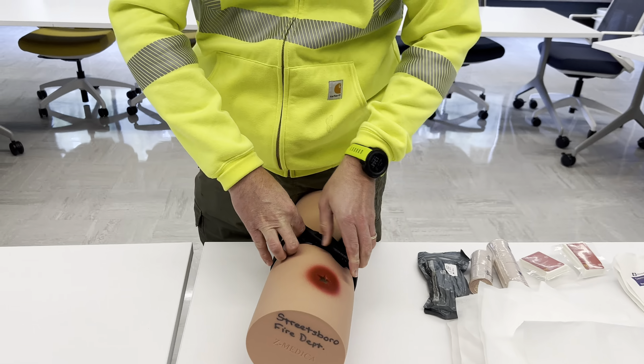Once you apply a tourniquet, you never remove it. If the first tourniquet doesn't stop the blood flow, you should apply a second tourniquet. The only people who should remove a tourniquet are medical professionals. If you have any questions about using the tourniquet, let us know and we'll come out and help you, but this should serve as a refresher video for how to apply it.